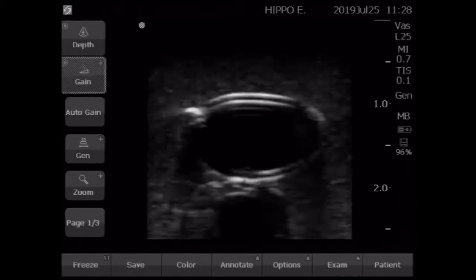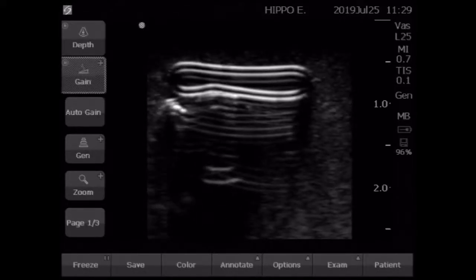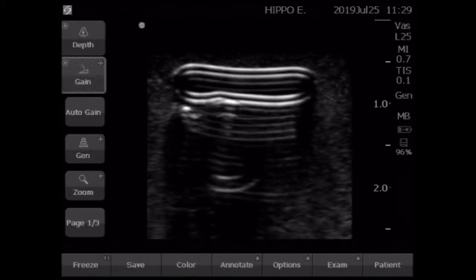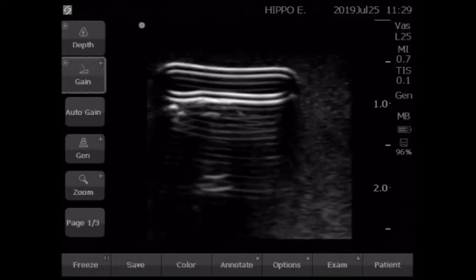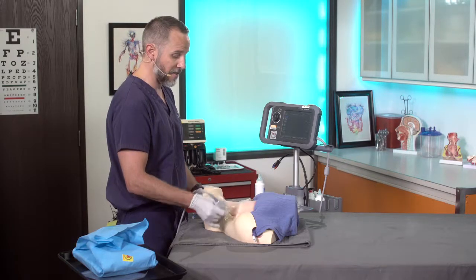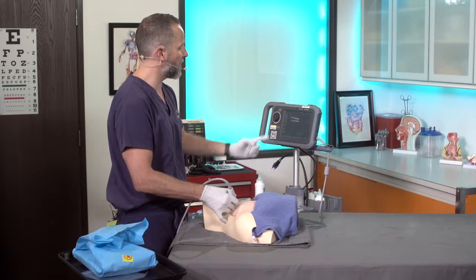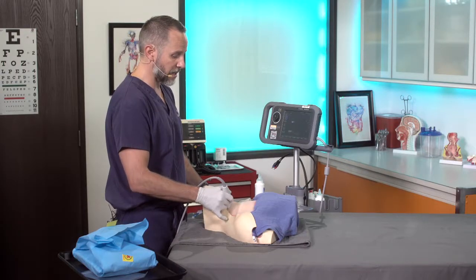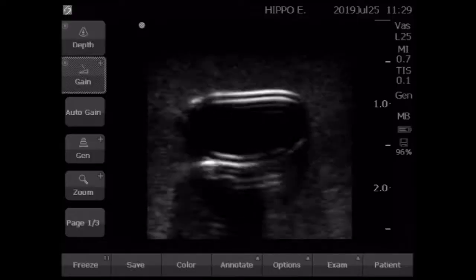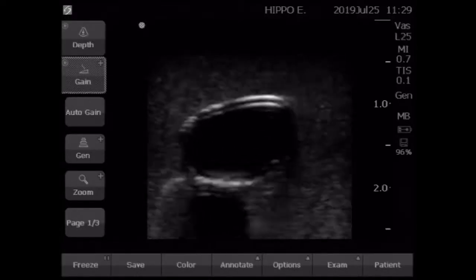How do you figure out which one's the vein and which one's the artery? Remember that the vein is compressible and the artery below is non-compressible, and usually it's going to be more pulsatile. In a human, you would see a compressible vein on the top and a pulsatile artery underneath it. Looking here, I'm going to identify a nice correlation of that vein, and so I'm going to want to prep this area.